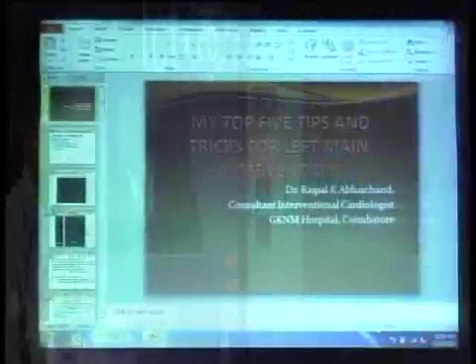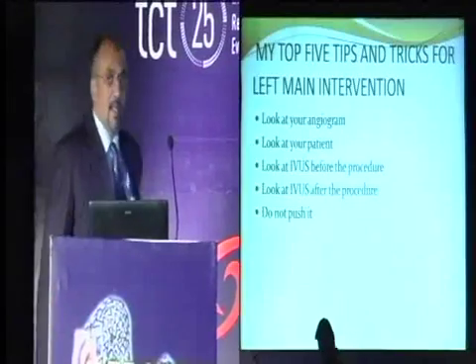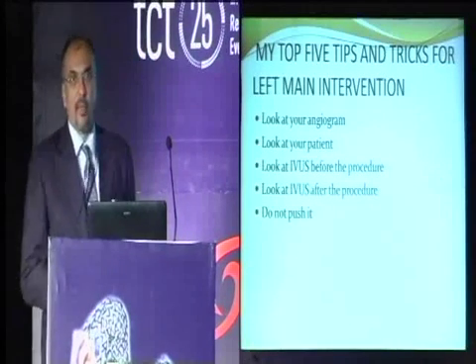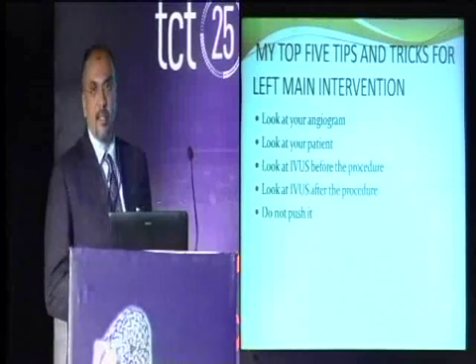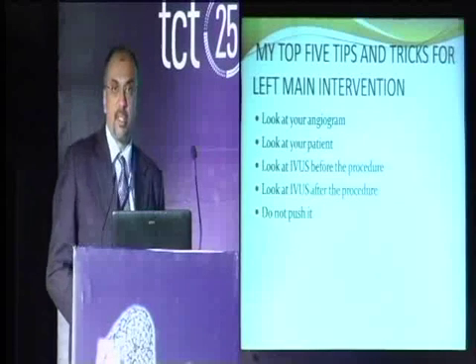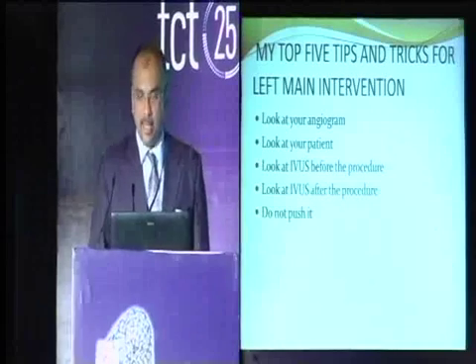So over the next 10 minutes, hopefully we will go through some important aspects of left main angioplasty. To begin with, the first important thing is, whenever you are embarking on a left main angioplasty, look at your angiogram. Look at your angiogram again and again. This is of paramount importance. Look at your patient. Look at IVUS before the procedure. Look at IVUS after the procedure. And finally, the fifth point will be, do not push it if you cannot handle it.